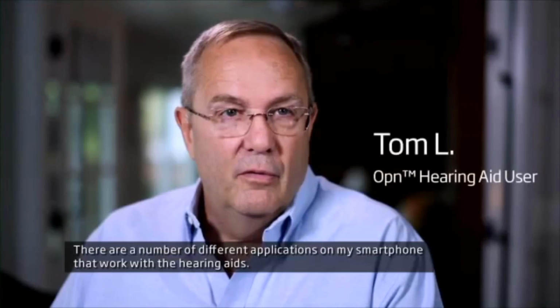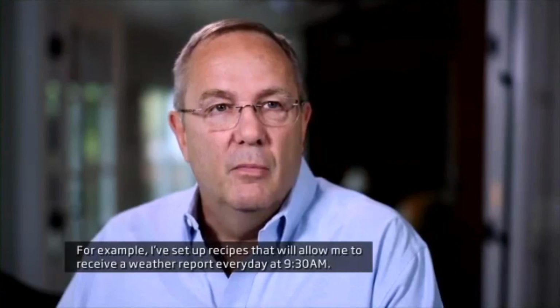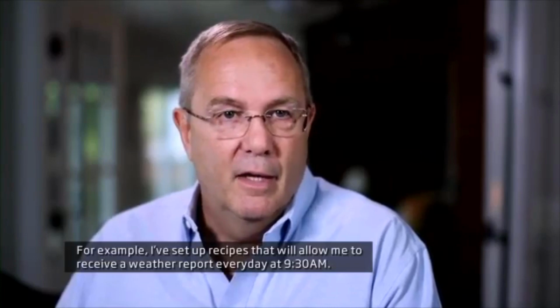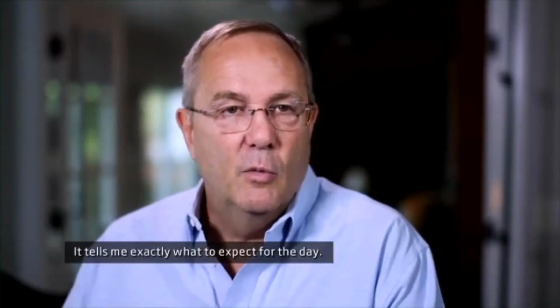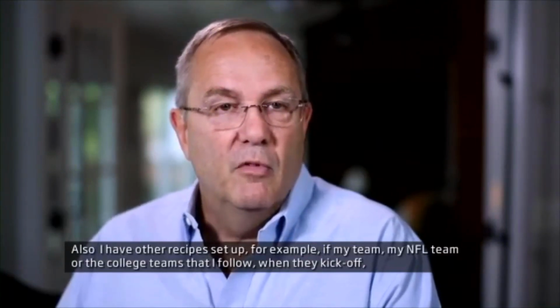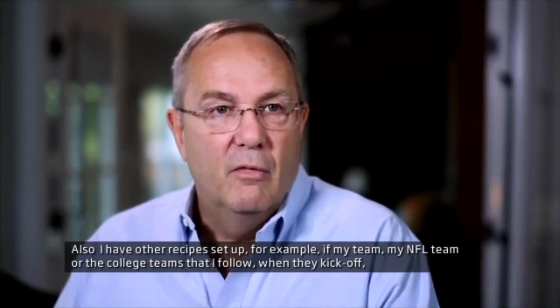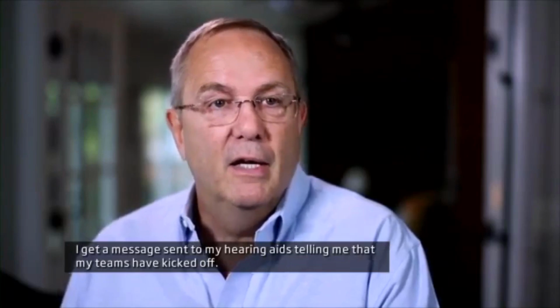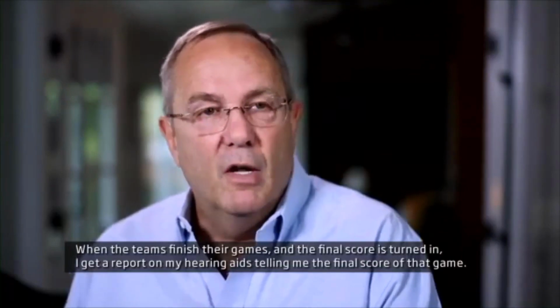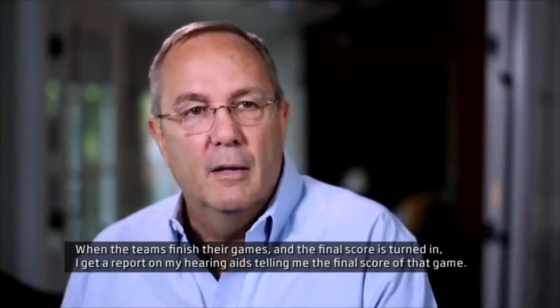There are a number of different applications on my smartphone that work with the hearing aids. For example, I've set up recipes that will allow me to receive a weather report every day at 9:30. It tells me exactly what to expect for the day. Also, I have other recipes set up. For example, when my NFL team or the college teams that I follow kick off, I get a message sent to my hearing aids telling me that my teams have kicked off. When the teams finish their game and the final score is turned in, I get a report on my hearing aids telling me the final score of that game.